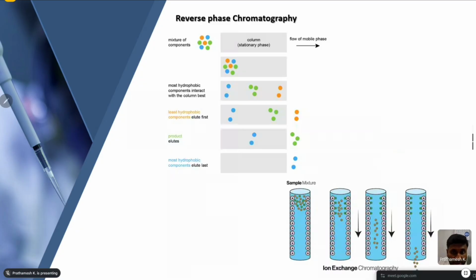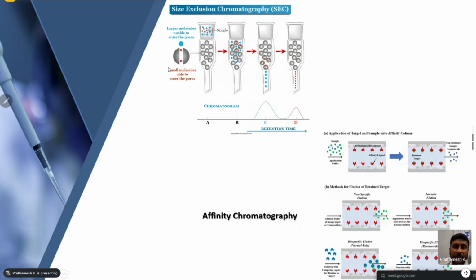Next is size exclusion or gel permeation. ये size exclusion chromatography देखो यहाँ पे. तो यहाँ पे क्या है, एक आपने ग्लास सिलेंडर लिया है, इसमें आपने बीड्स डाले, सिलिका के बीड्स बोलो या अगार के बीड्स बोलो. They are porous beads. Okay, so they individually have small pores also in it. So here the separation is basically happening on the basis of size exclusion or gel permeation. So here you have a sample which has analytes of different sizes. Here is your column which is packed with porous beads or agar beads, and now I have added the saline.